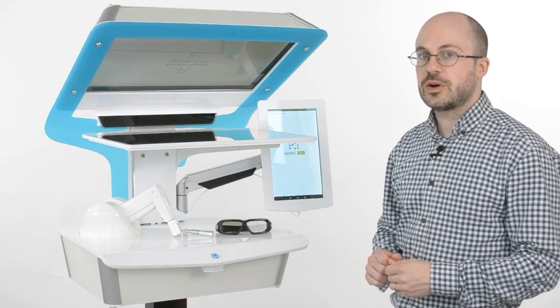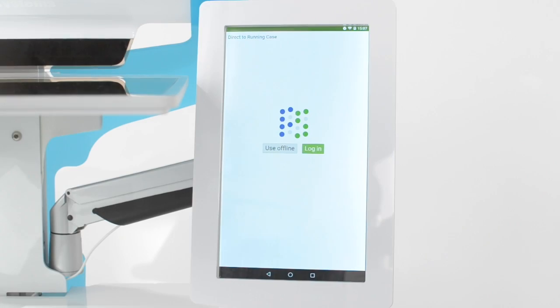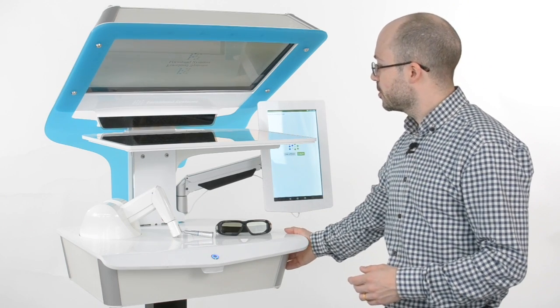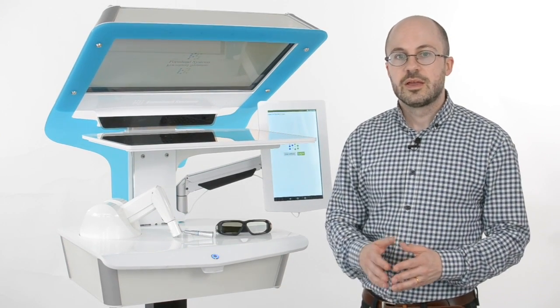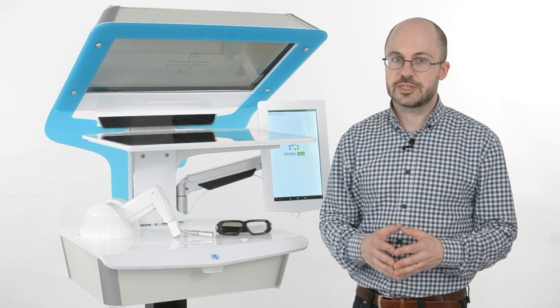You start it with one press of a single button and then you control it from the side screen. The whole unit is height adjustable for ergonomic positioning. If you have limited space, you can also use it without the stand on a regular table.